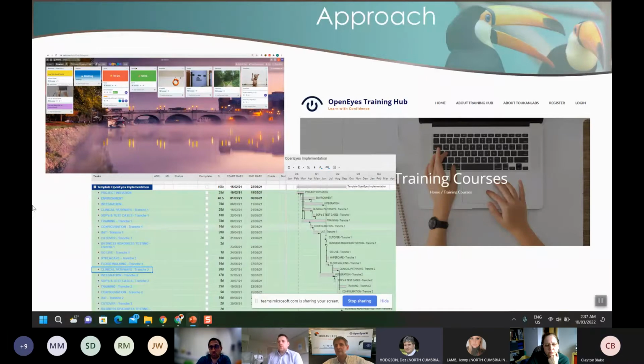We have limited groups within each Active Directory and only live users are put into those groups. But because we're in the process of migrating, that's a very general field there. So it can be quite interesting keeping that up to date. And we want to avoid people ringing up saying, oh, I used to be able to get access yesterday, but I can't today. So yeah, it's a bit of a problem. It's a challenge, shall we say?